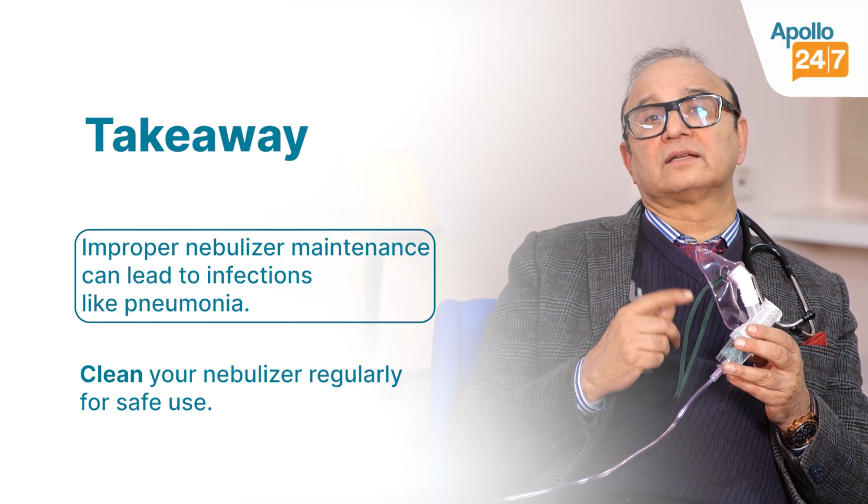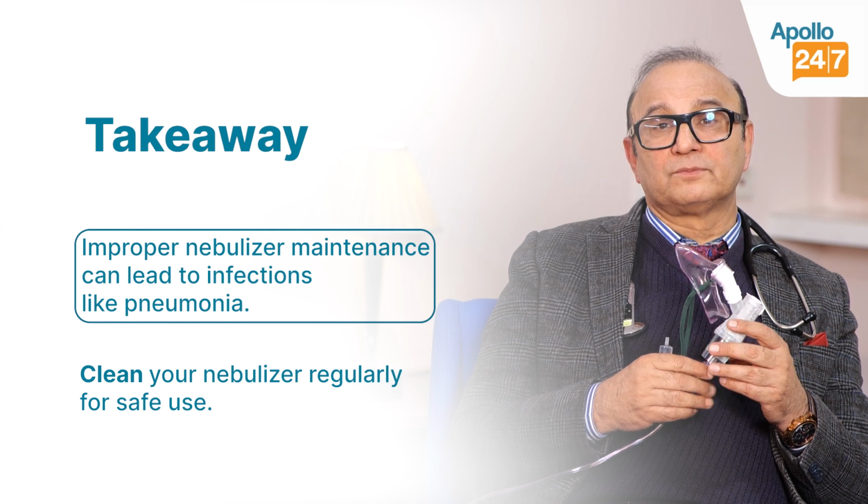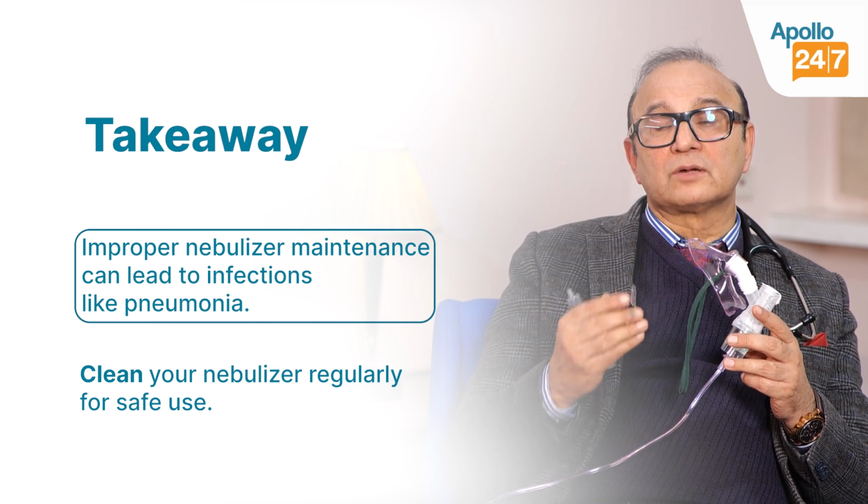And if you do not maintain it, it can get infected and it can cause pneumonias and other infections. So you must keep it clean before using regularly for your patient.